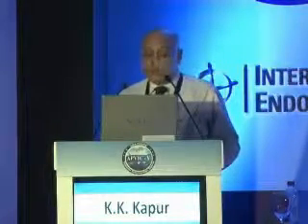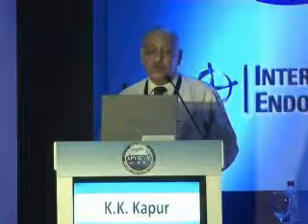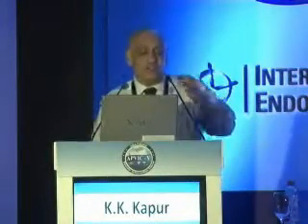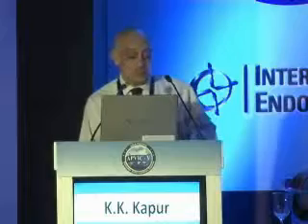The normal response is the complete absence of antegrade venous flow and no backflow. Venous incompetence is characterized by a prominent retrograde flow. A very brief flow reversal is seen during the initial strain. That is seen almost in every patient, and less than half a second is considered normal. So that should not be called a venous incompetence.